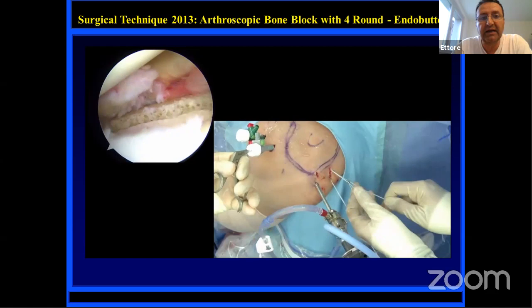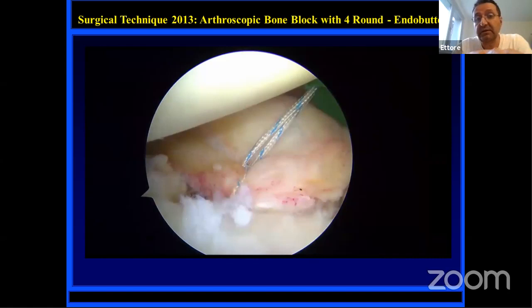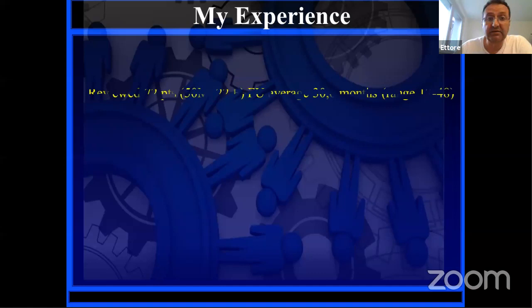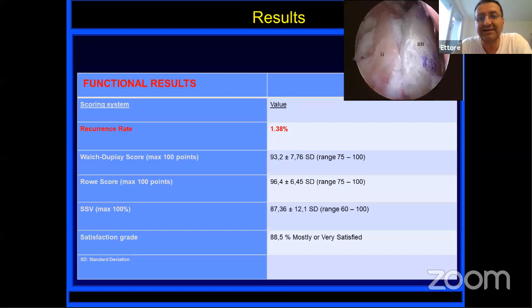And then when you do this, on top of that, you do your Bankart repair. So in my opinion, this is the real Bankart plus. It's a Bankart repair and restoring the bone defect in patients with soft tissue detachment and bony defects. They don't need a Latarjet. It's sufficient to do this, because following my indication, I did more than 150 cases. I don't consider the cases I did before 2013 with the screws, which actually had similar results. And these were, you know, good results. The recurrence rate in these patients is less than 2%, absolutely similar to most of the papers reporting on Latarjet.